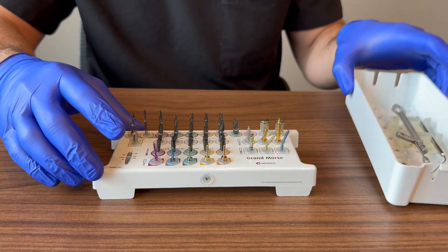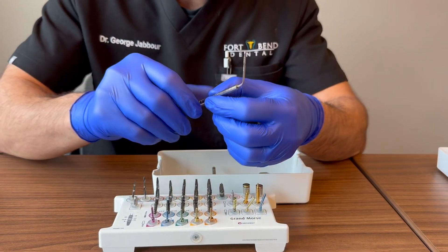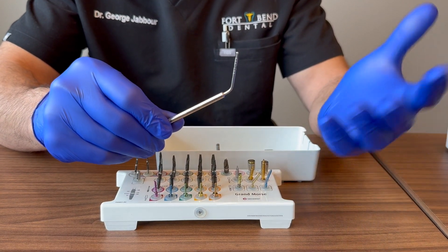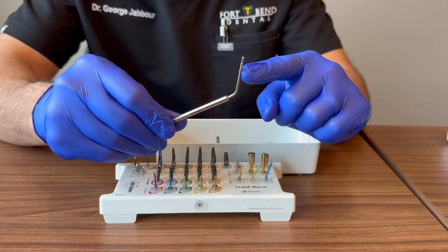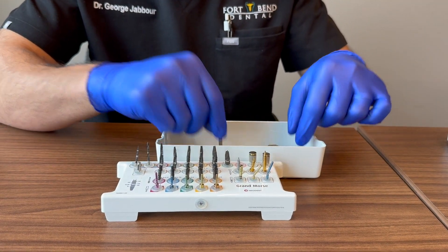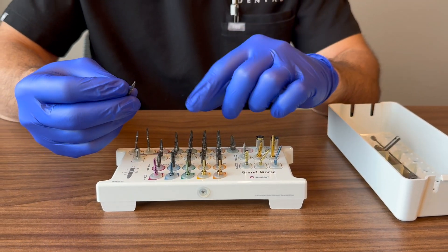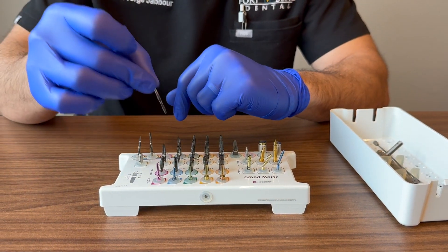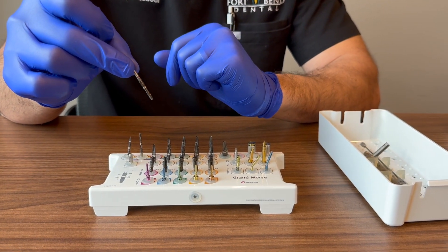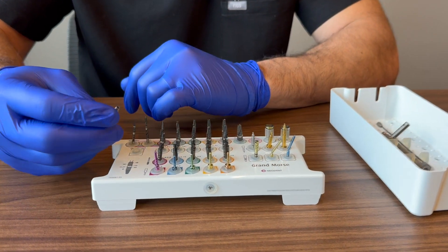There's also a depth gauge in the kit — essentially a fancy perio probe with millimeter markings so you can see how deep your osteotomy is. Personally, I prefer using the implant drill itself: take it off the handpiece, stick it back in the osteotomy, and read the depth marking directly for an accurate measurement.